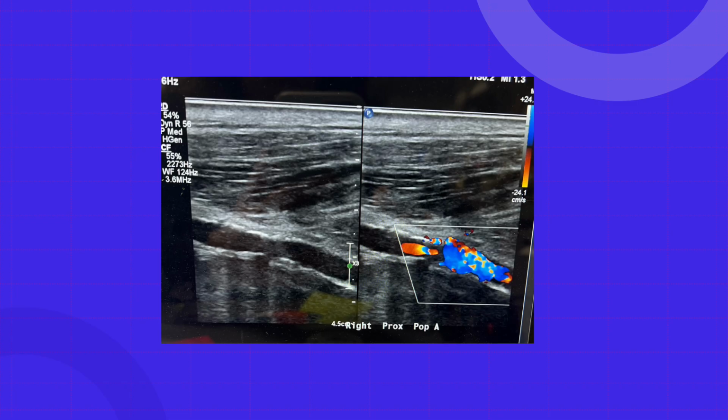You can see, to the left on the color box, where the color starts to get yellow and blue. And then after that, the color's blue and sort of chaotic. So that is a stenosis right there. That would draw my attention to stop. Okay, let me Doppler that. You're going to get probably a really high velocity right here. Okay, I'm going to go before that in Doppler, at the highest velocity, and then after.